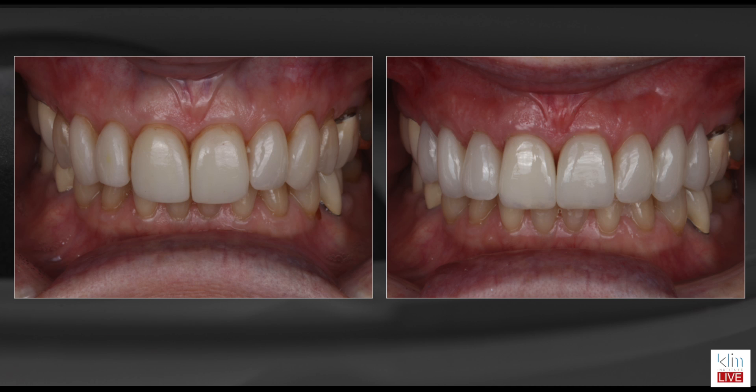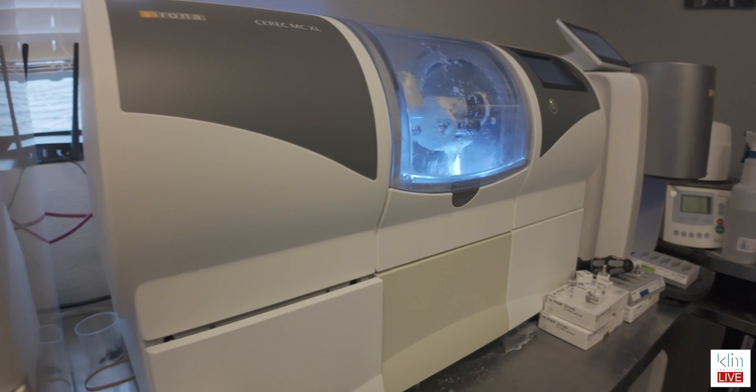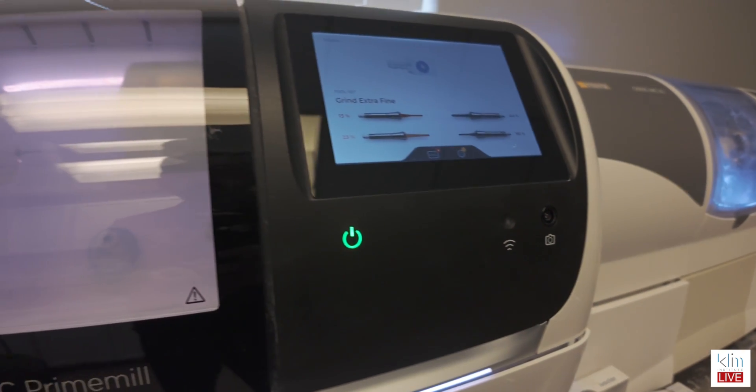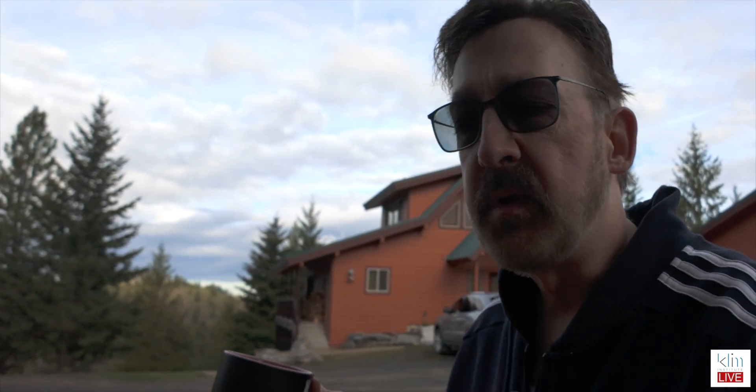One thing I did want to talk about that I experienced this week is I did a veneer case. I prepped it on Monday and seated it on Wednesday. Everything was going well until I got to the anterior teeth. Somehow I just could not get those lingual margins closed in the way that it was milling. I do extra fine mill — it just definitely works much better. I was using extra fine mill on the prime mill. The problem with the initial burr pass is that you have the left burr, which is the step type of burr, and it's 1.4, and that was over-milling too much, particularly with conservative veneers.